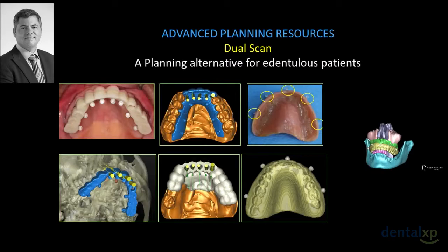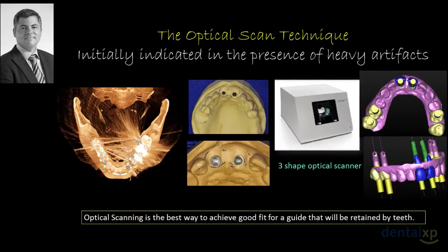The optical scan is the other advanced protocol utilized for planning a computer-guided case. The data is captured intraorally or from models using an intraoral scan or a tabletop model, and it is then imported into the interactive software. Any artifacts are removed using the optical data as a guide. This is a technique-sensitive procedure and very delicate and time-consuming. Errors in this process come back at you at a very hard price, therefore the need to learn or work with a knowledgeable mentor in this area.